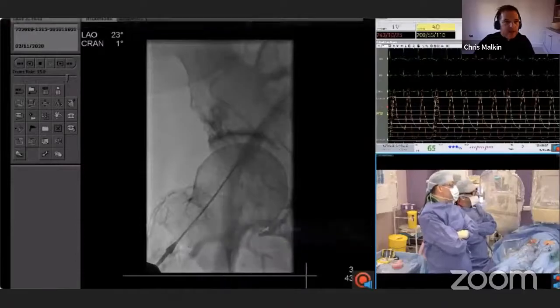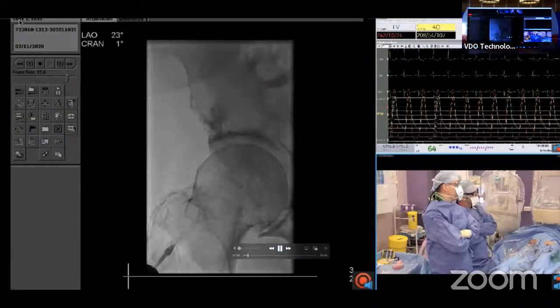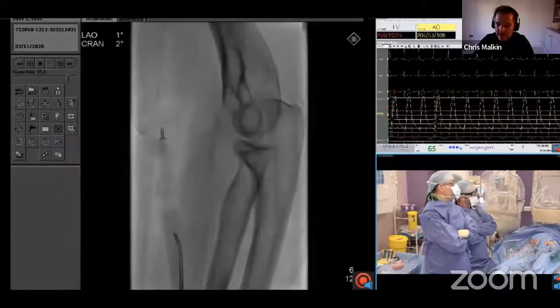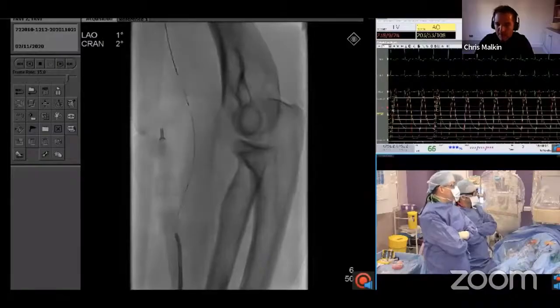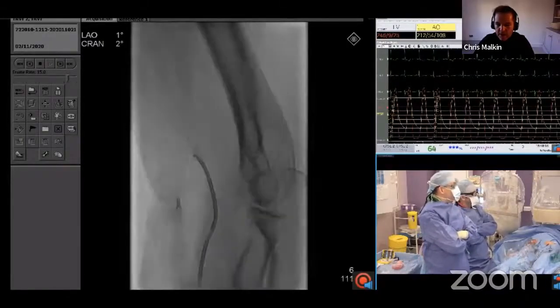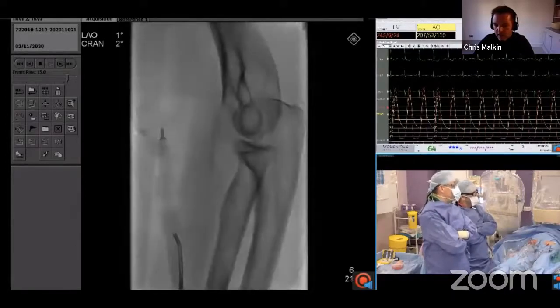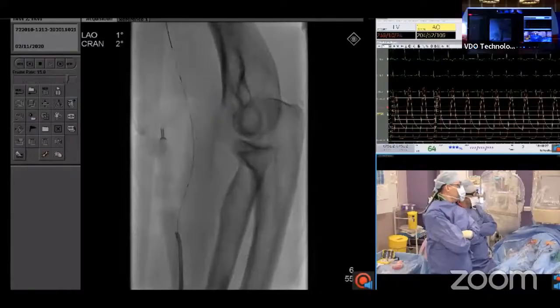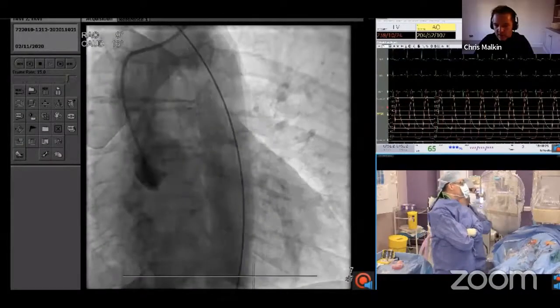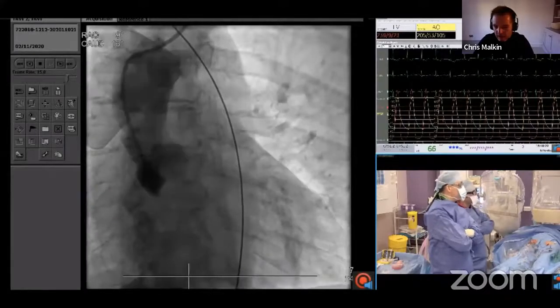So this is a case that I performed with my colleague, Dr. Cunnington. On the right panel, you can see the cath lab. This is a very high volume modern TAVI center in the UK. It's a light touch procedure. There is no anesthetist in the room. There's a nurse looking after the patient. There are two consultant operators working with a scrub nurse. The patient is not sedated.